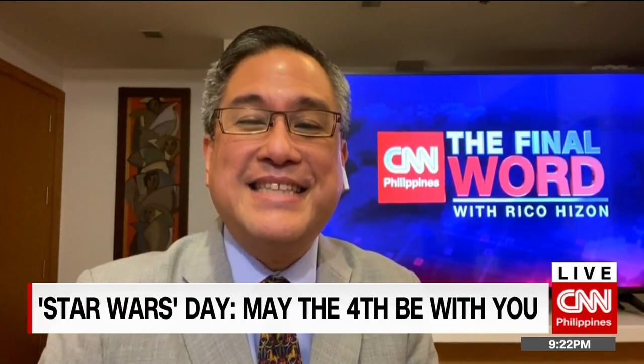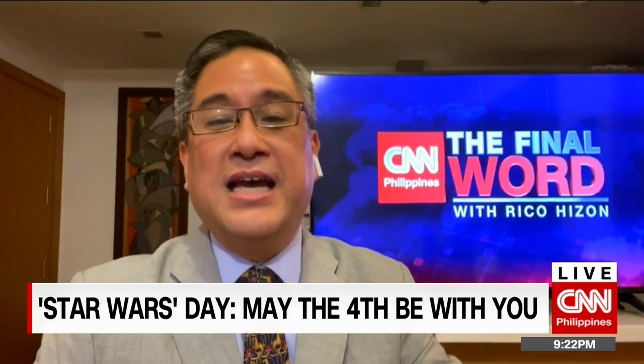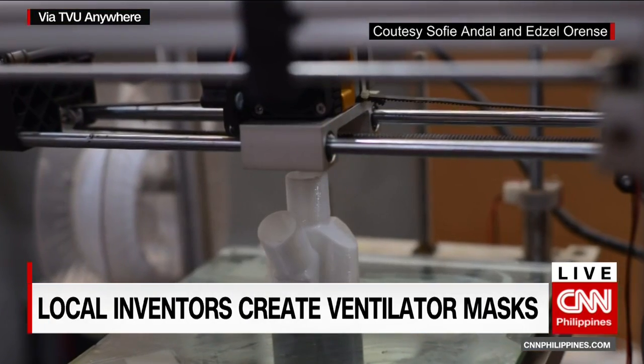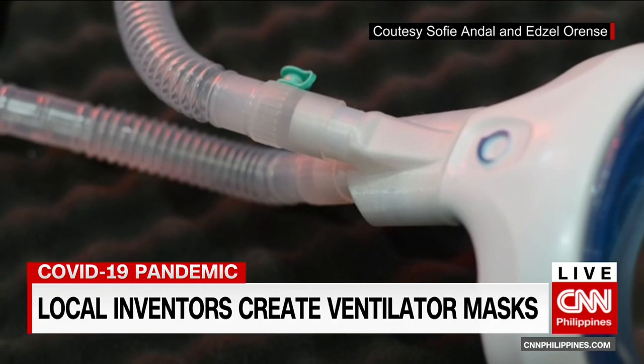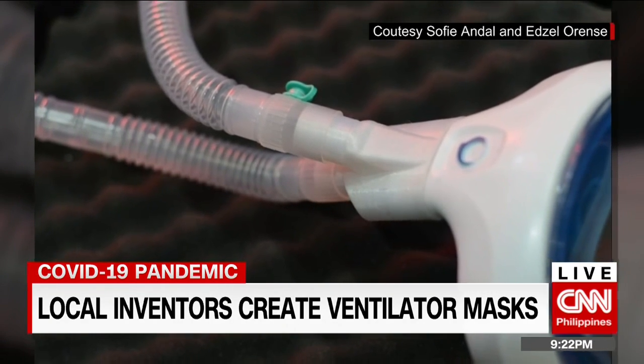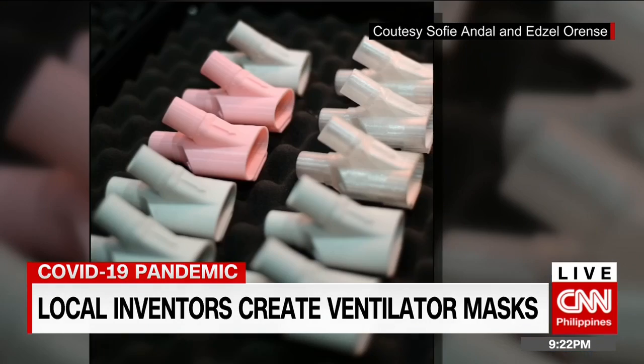Essential equipment in the fight against this deadly virus are ventilators. But with more cases adding up, demand for the machines is also rising. Now a pair of Filipino inventors got some inspiration from Italy, where makeshift ventilator masks were first made. We find out more from Arnel Andal and Edsel Orense, creators of the AOT VentiMask.